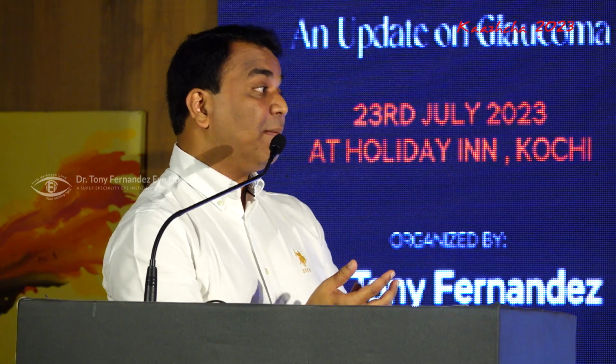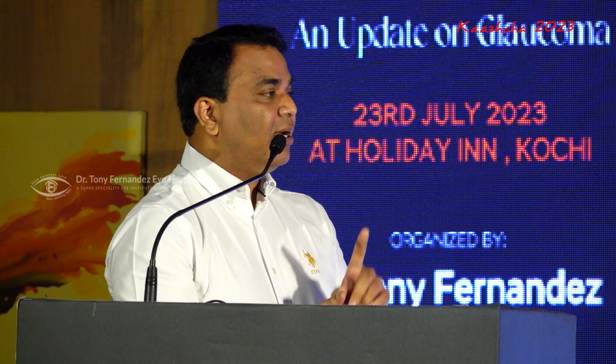Yes, as I showed in my presentation, it is not only subconjunctival fibrosis; sometimes subscleral fibrosis is also a cause of bleb failure. So internal bleb needling works beautifully when we have subscleral fibrosis. Once you remove the subscleral fibrosis, you can go in with the needle, which is quite long, with an atraumatic tapered round tip.